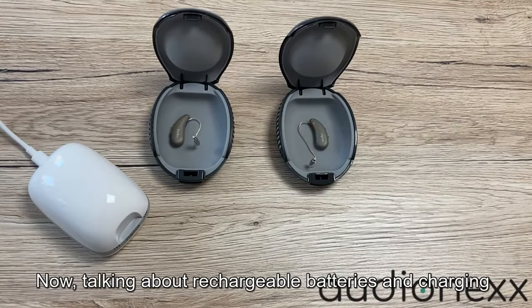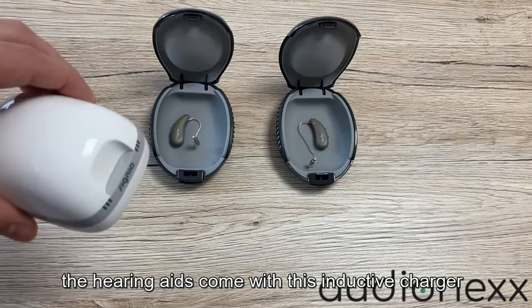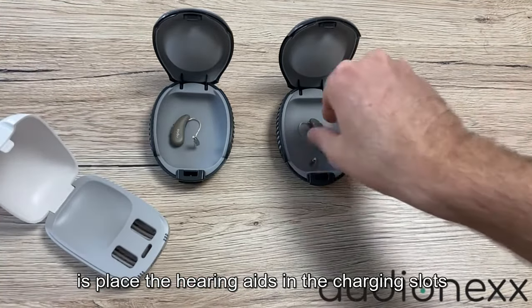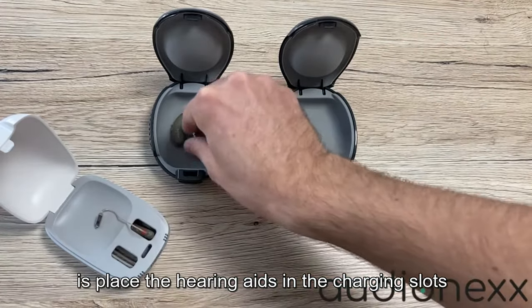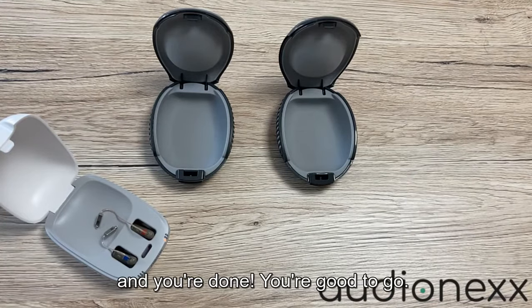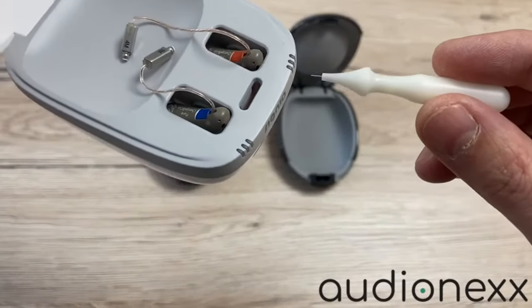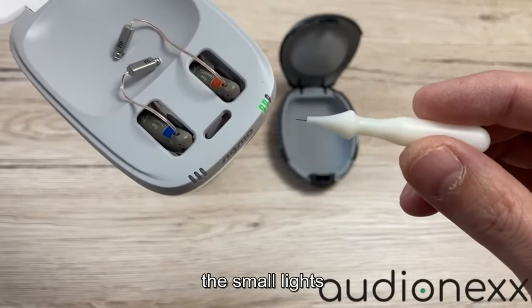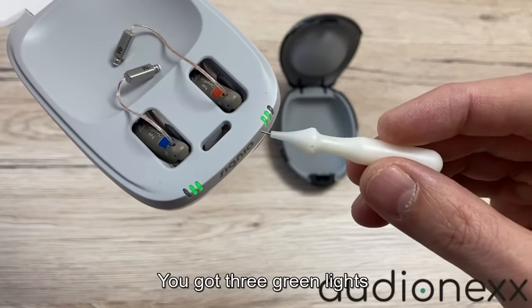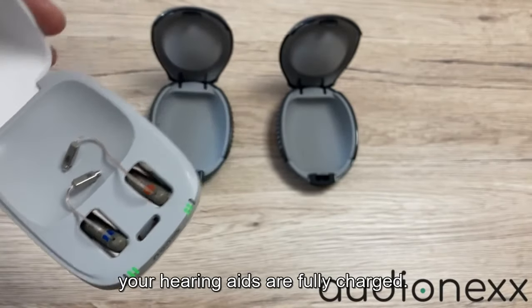Now talking about rechargeable batteries and charging — the hearing aids come with an inductive charger and all you have to do is place the hearing aids in the charging slots and you're done. As you can see here, the small lights show you the charging status. You get three green lights, and when all of those lights are green your hearing aids are fully charged.